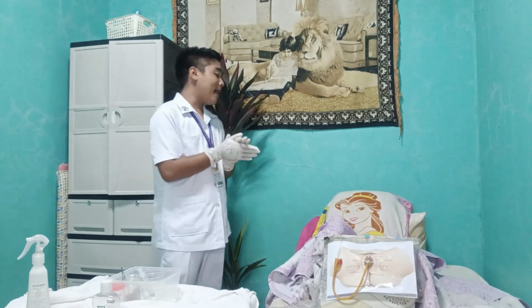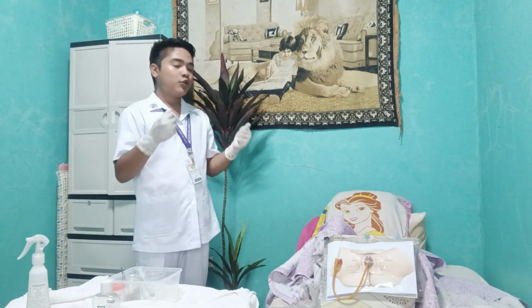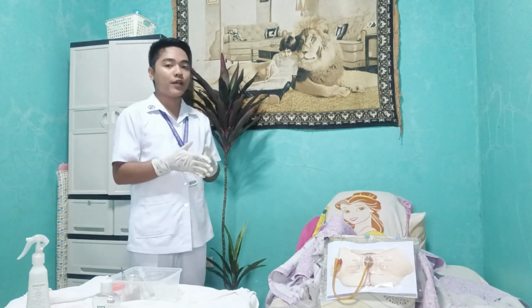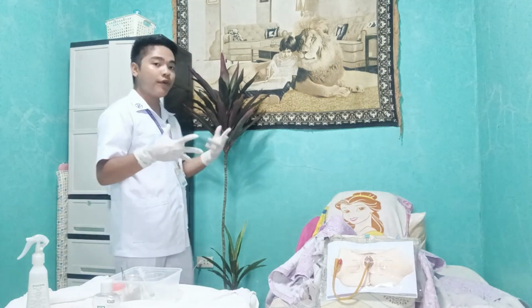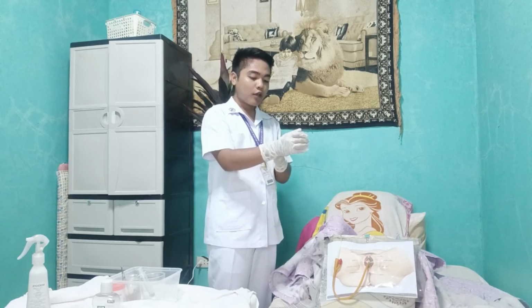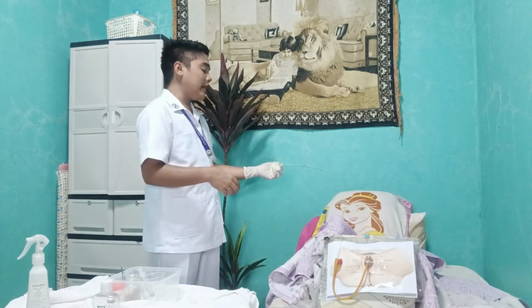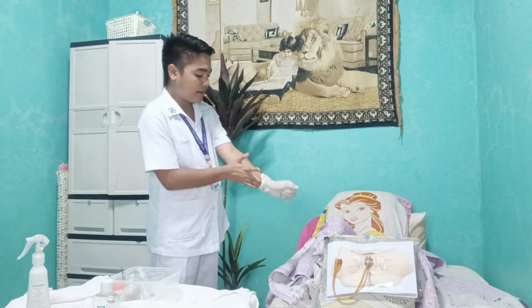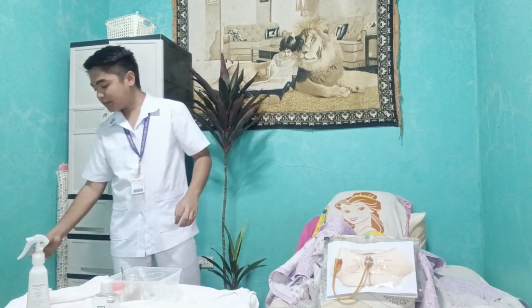Now we're done, ma'am, and I'm just going to cover you up to provide you comfort, and I am going to take this bag below you. Then I am going to remove my gloves now. I will first remove my gloves so that your bed sheets or your linens will not be contaminated. Properly discard the gloves.